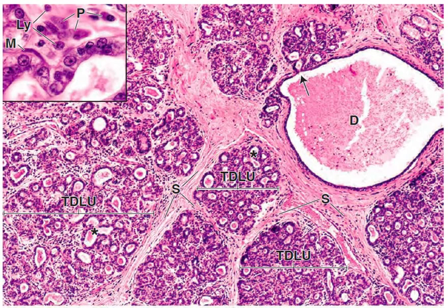Alveolar development becomes most prominent in the later stages of pregnancy, and the accumulation of secretory product takes place in the alveoli. At the same time, lymphocytes and plasma cells become prominent in the loose connective tissue of the developing lobules. Myoepithelial cells proliferate between the base of the epithelial cells and the basal lamina in both the alveolar and the ductal portion of the glands. They're most prominent in the larger ducts.